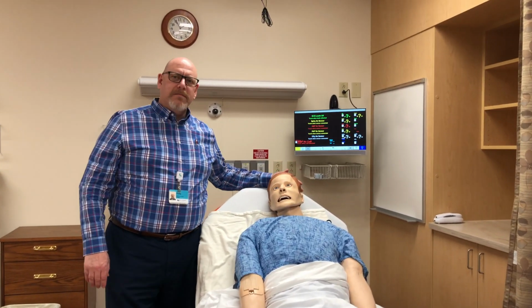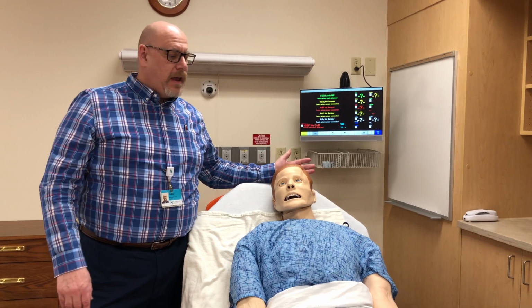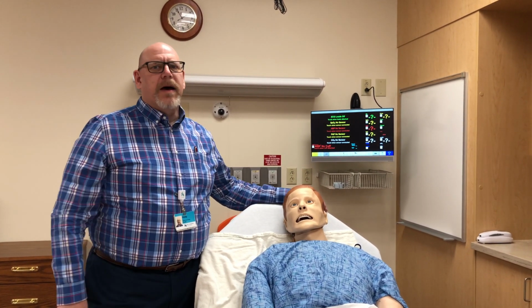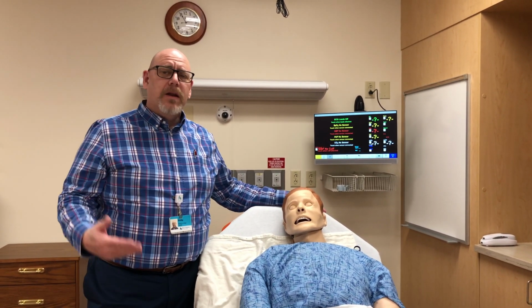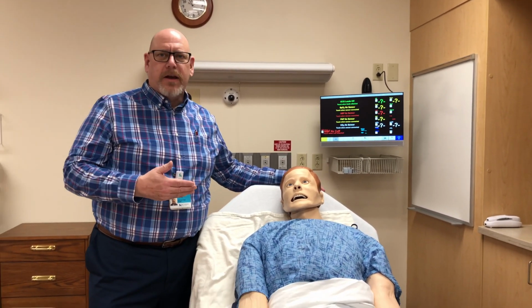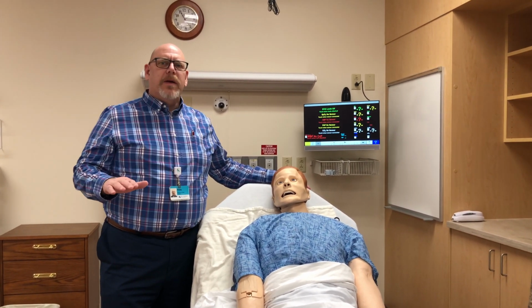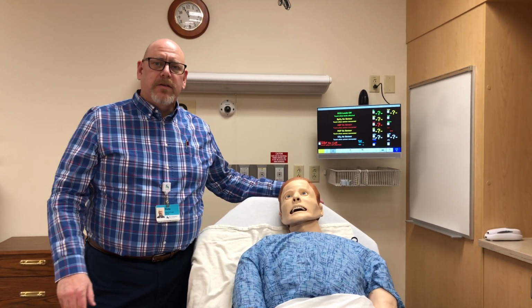This is SimMan, and SimMan is what we call a high fidelity simulator. And we call it that because although it's plastic, we can mimic just about any kind of human pathology that we know of. So we can make this patient bleed, we can give this patient cardiac arrest, respiratory arrest, any other kind of ailment that we need to train our nurses on. We can make this mannequin do that.